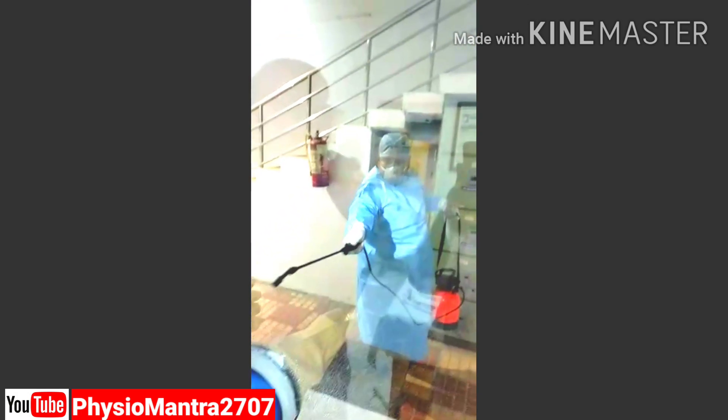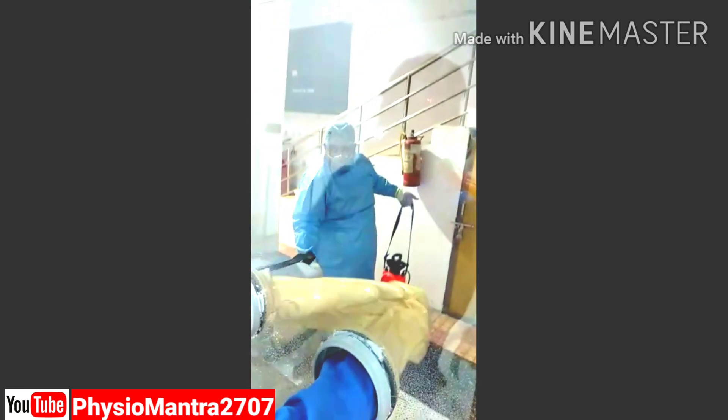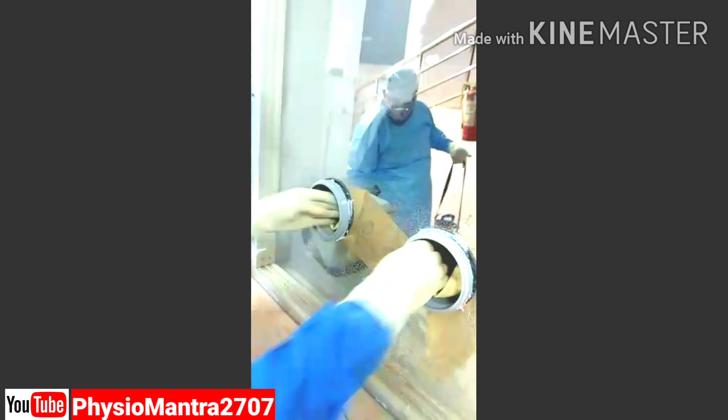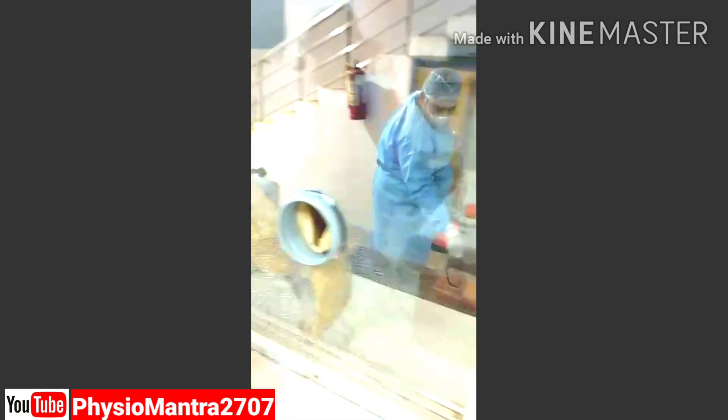The person is protected with PPE of the operation theater. Hands are removed now. That is the total procedure.